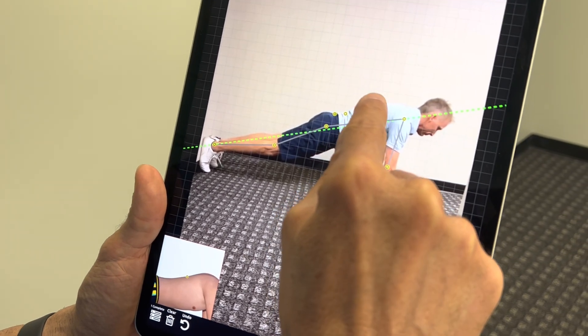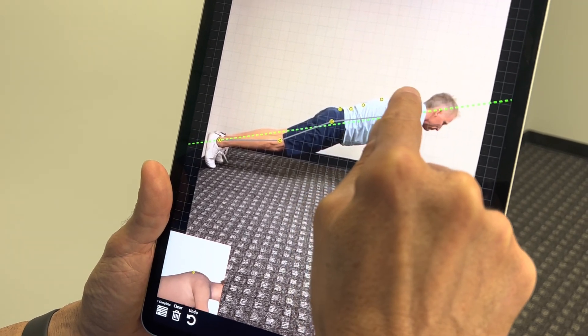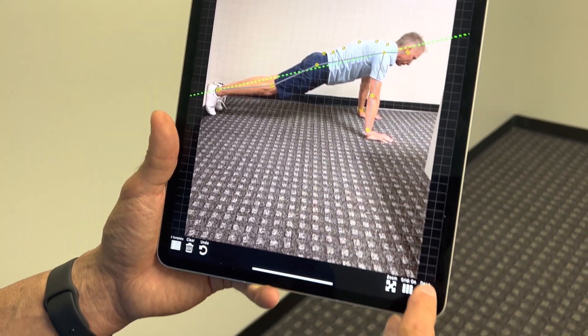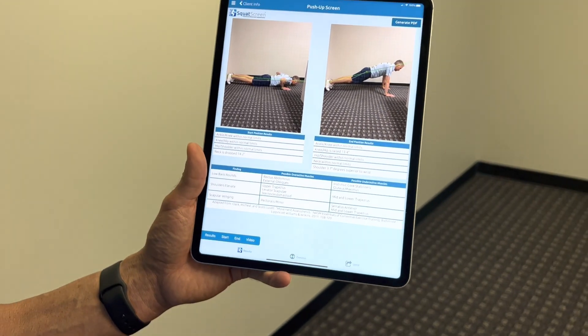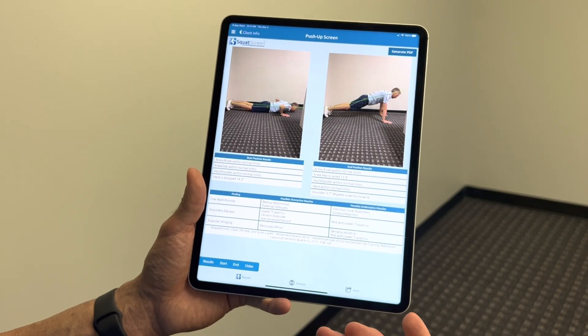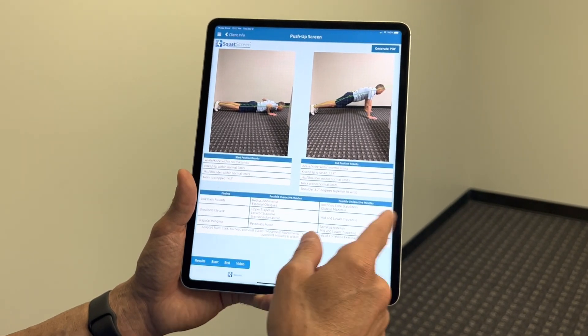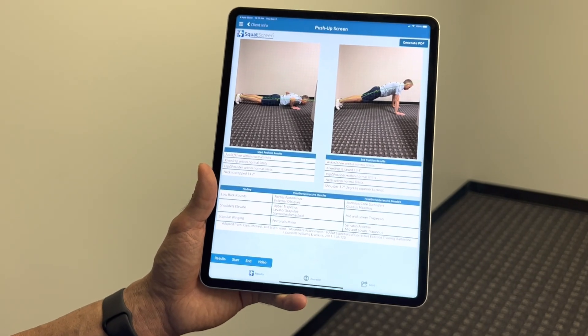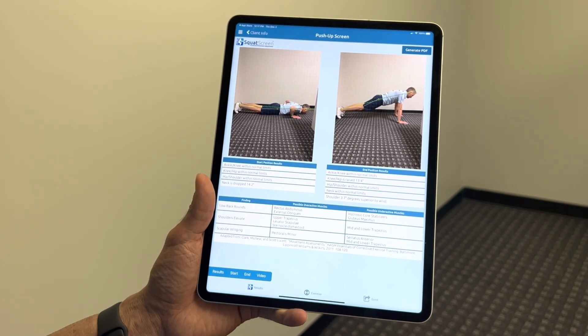Once we're done, we can view the same reports as other screens — possible overactive muscles, possible underactive muscles to focus on — and pull up exercises if you're linked to web exercises. That's how you do a push-up/plank screen with PostureScreen. If you have any additional questions, reach out to support at posturescreen.com. Thank you, bye bye.